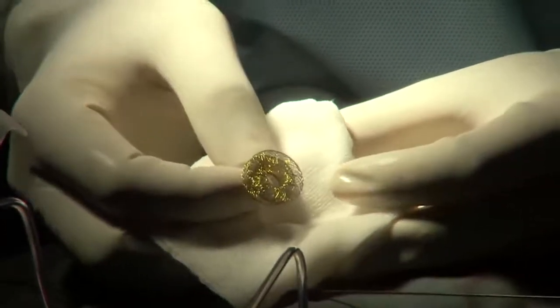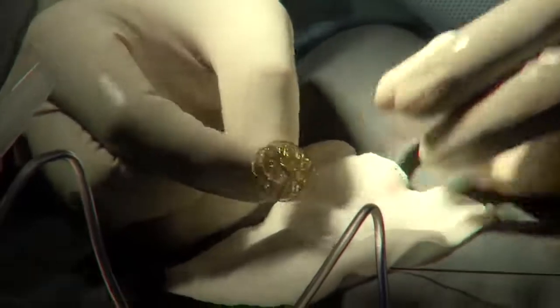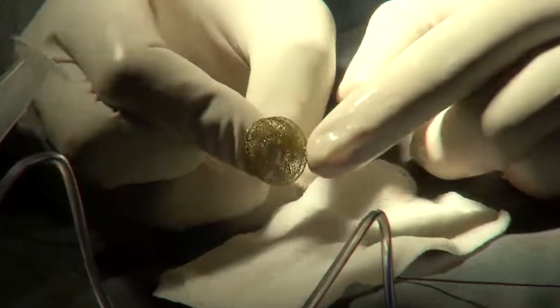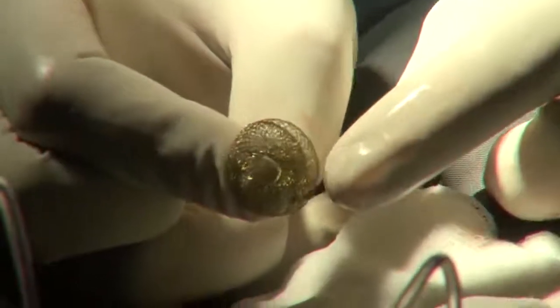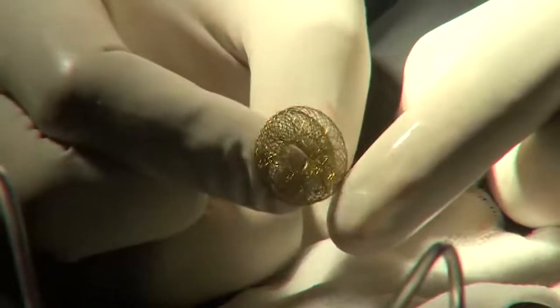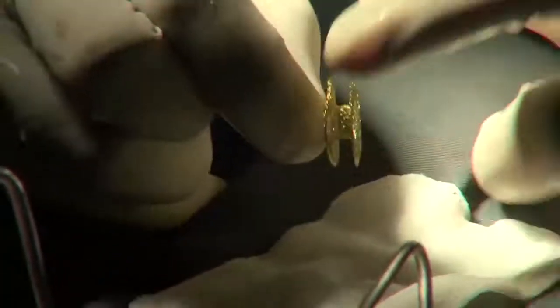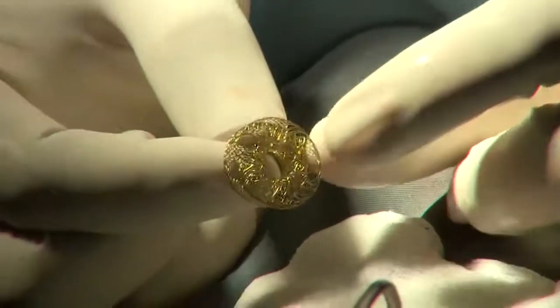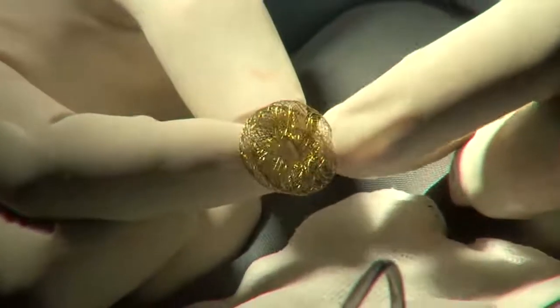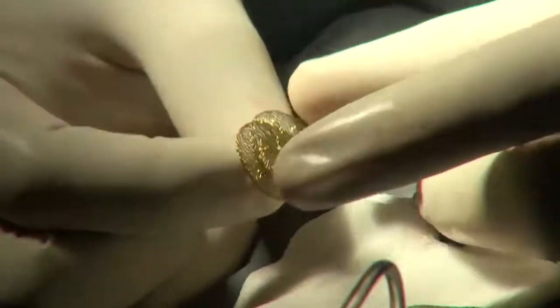Yes. And you... one at a time, guys. Yes. The question is whether 6 is too large. What I am thinking now to do is, I am skeptical about 4. 4 is too small. I am planning to put a Prolene stitch around this waist and slightly restrict it to 5. Don't do this. Don't do this.